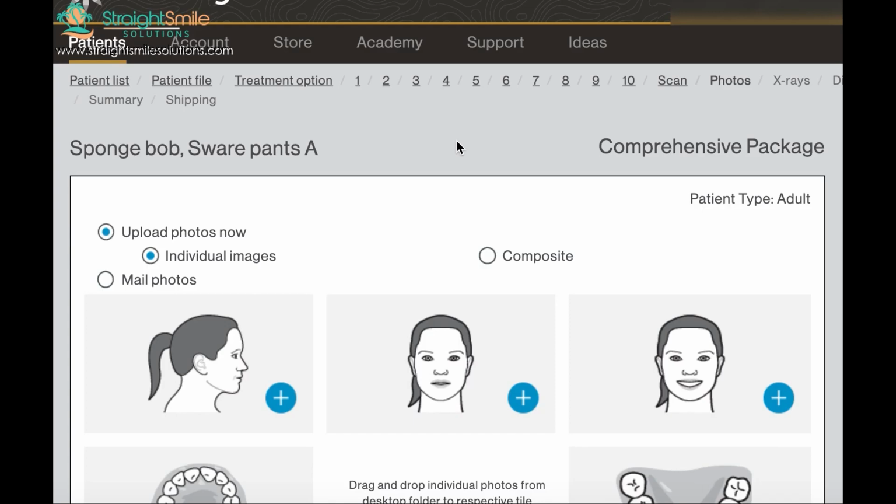Who wants to have impressions done? Nobody. And there's nothing worse than getting a patient all jazzed up about Invisalign, doing the impression, and finding out it's rejected, which will happen about 50% of the time. I don't care how good you are. And the patients get mad. So it's not worth it. It really isn't.